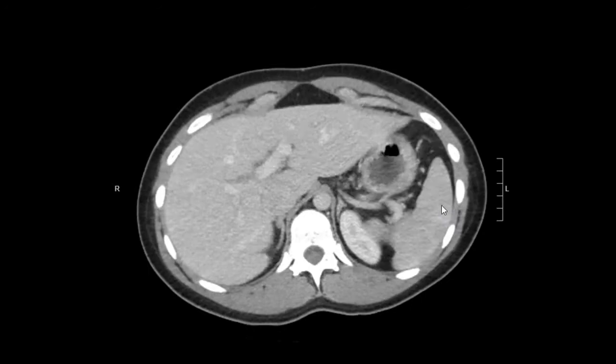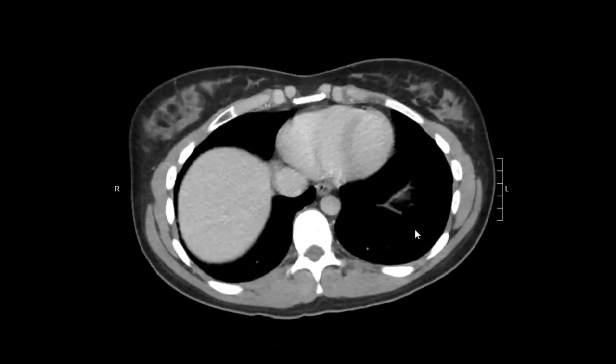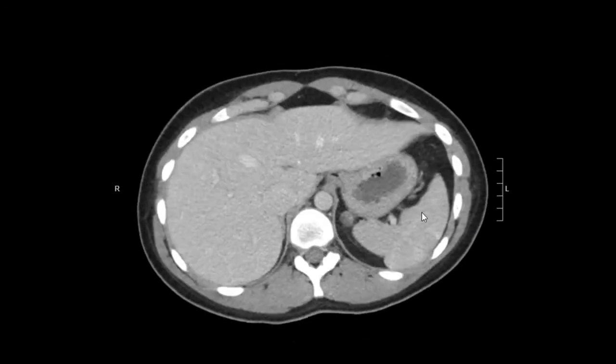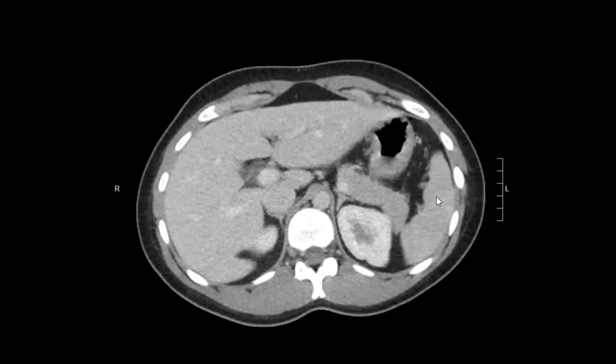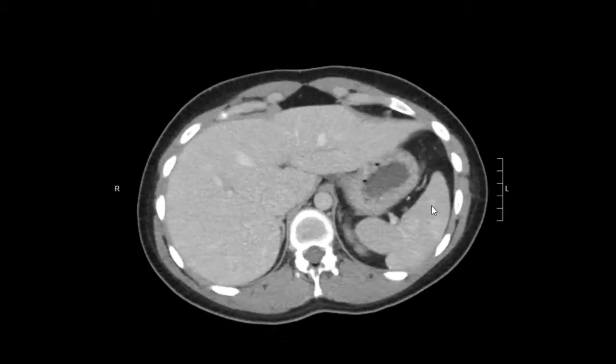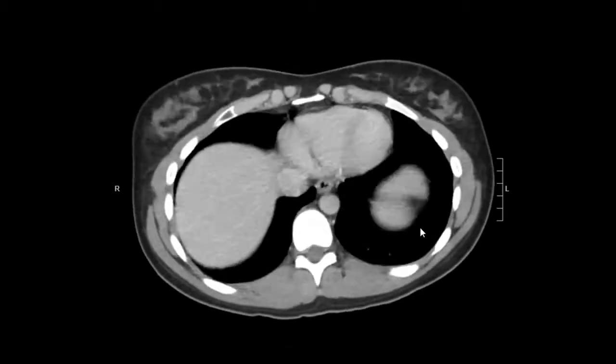I'm going to look at the spleen from top to bottom. Same thing — normal in size, normal in contour, normal in density.